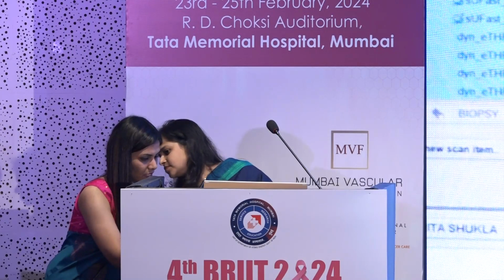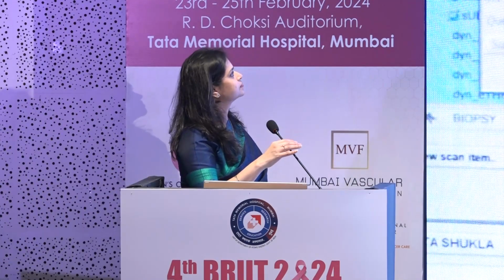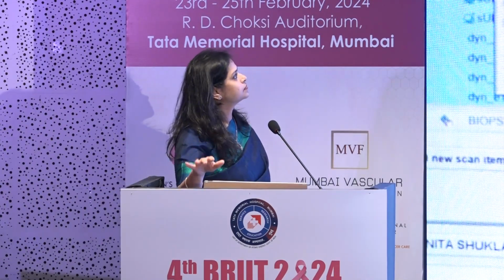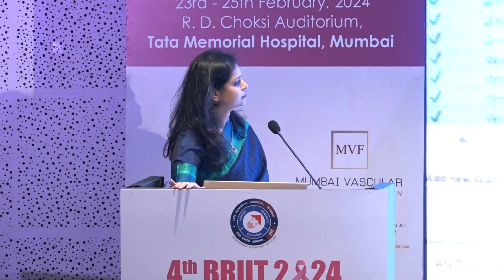So this is the subtracted fourth image, and this is being sent to DynaCAD. So now we have sent it to DynaCAD. We will check open. So we have the CC marker detection and the required sequences coming. So we start scrolling. We just saw something. And we will go back. This is on the upper side.